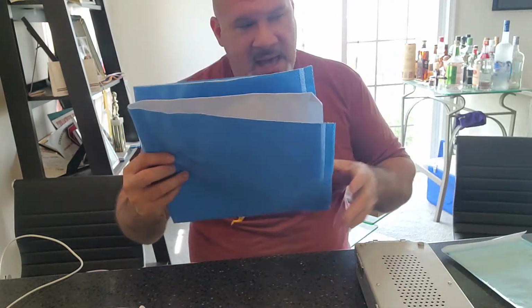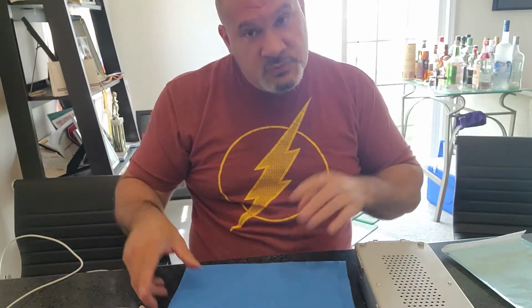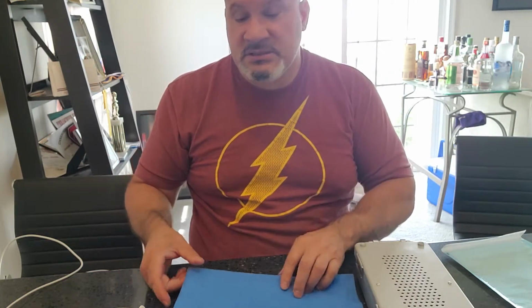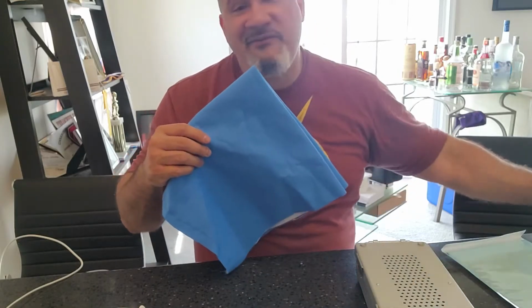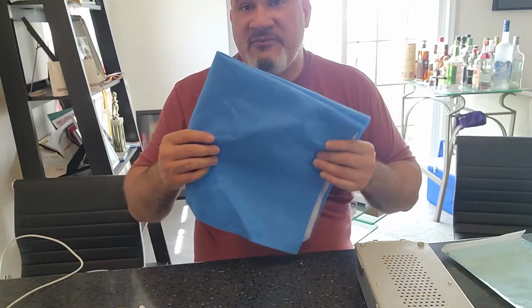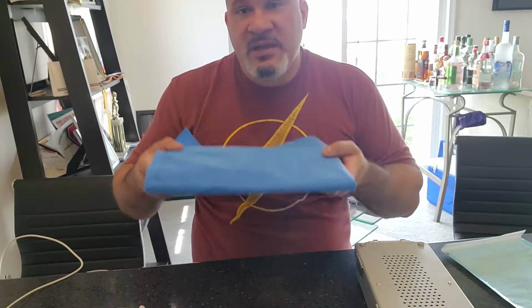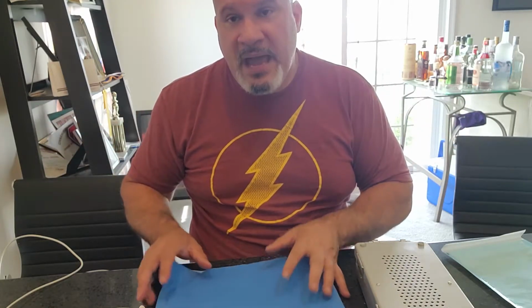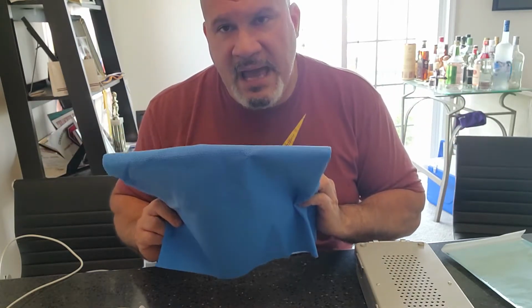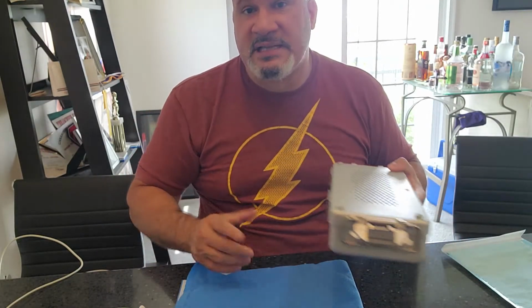Can you wrap a mallet? Yes, you can. You can wrap it. Okay, but again, if you toss it down a little too rough, there's going to be a hole in that wrapper. I don't care if you use a lint-free towel, if you use a lint-free wrap, if you put corners on it, if you drop or mishandle the package, you will put a hole in the package. Protectors or no protector. Better choice is a rigid container for something that dense.